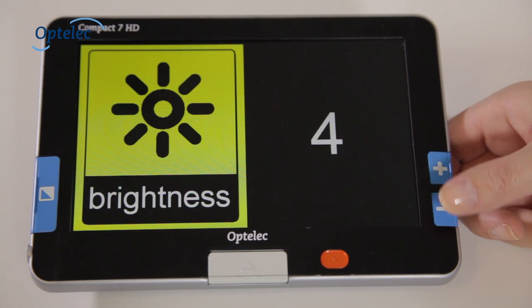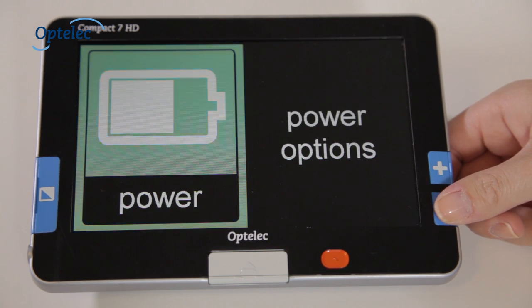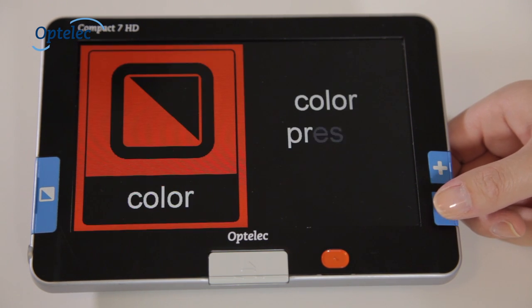The menu allows you to adjust the settings. This includes brightness, power consumption, sounds, lighting, and contrast.